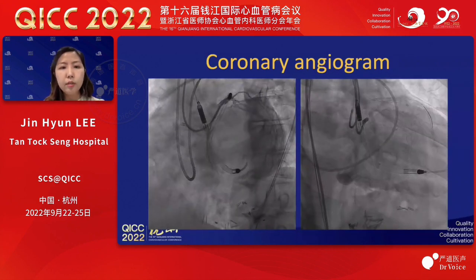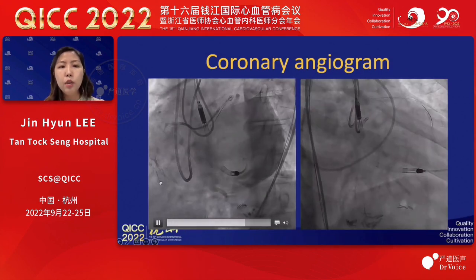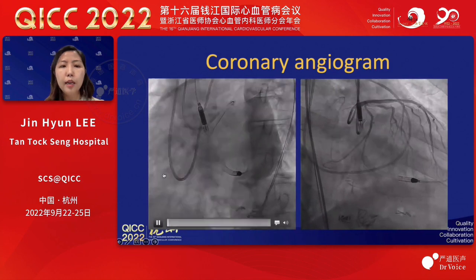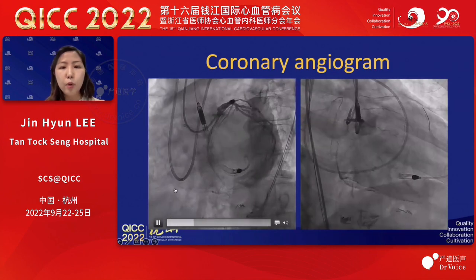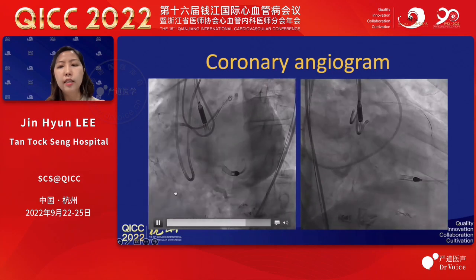So this was the angiogram that was taken, and it basically shows a long CTO segment with a tapered proximal stump and a blunt distal stump. The length is about 40 mm with septals collateralizing the RCA, and it looks like there's a good landing zone.